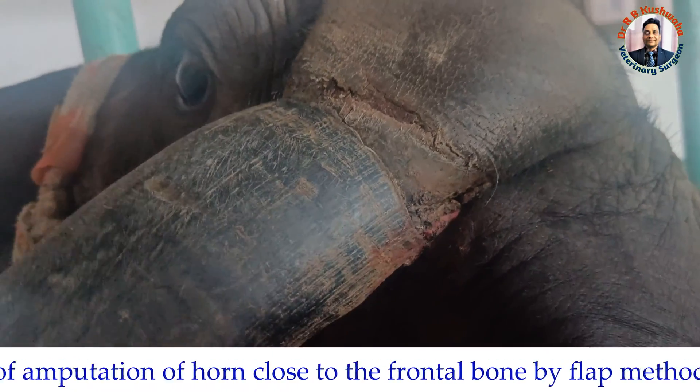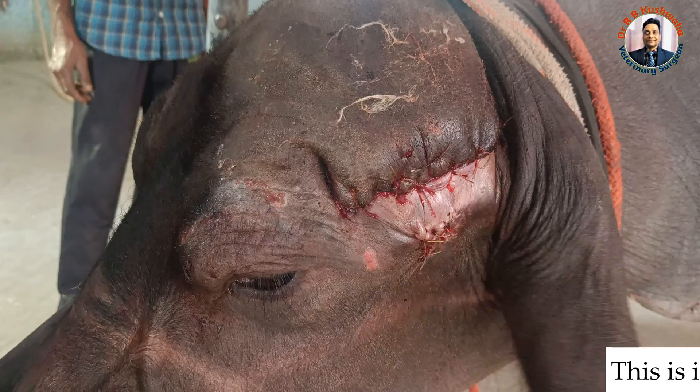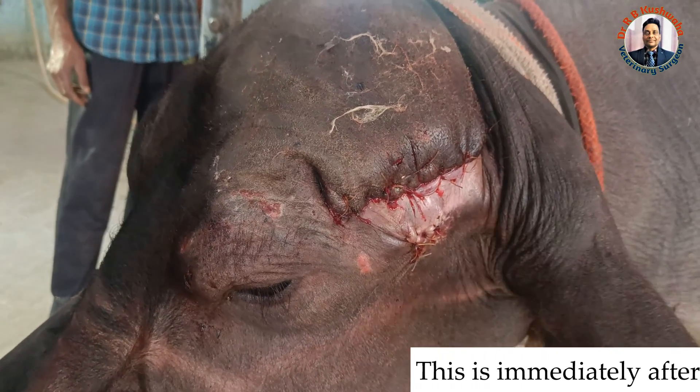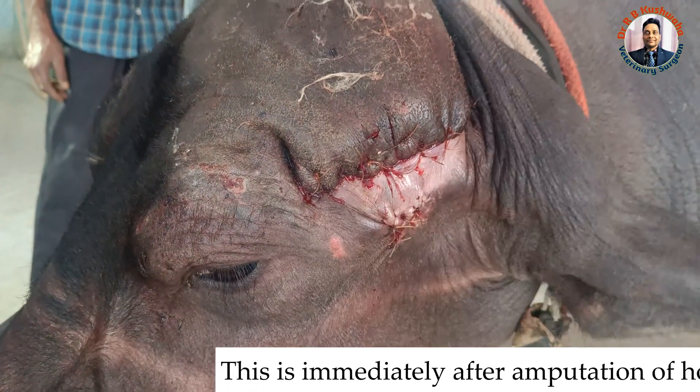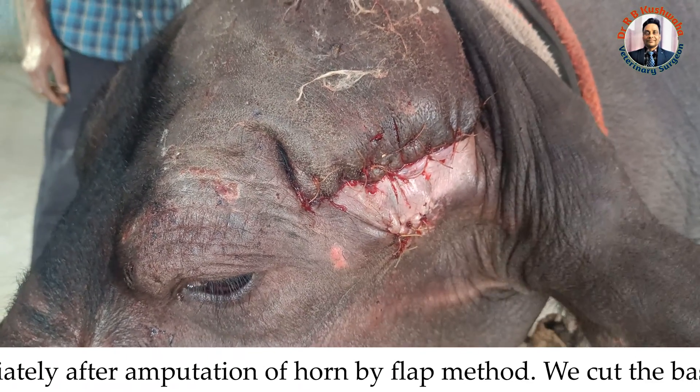In this case we will go for the amputation of the horn from the base. This is immediately after amputation of the horn. You can see how beautifully we are able to oppose the skin together, which is otherwise very difficult in the buffalo because of the massive horn.